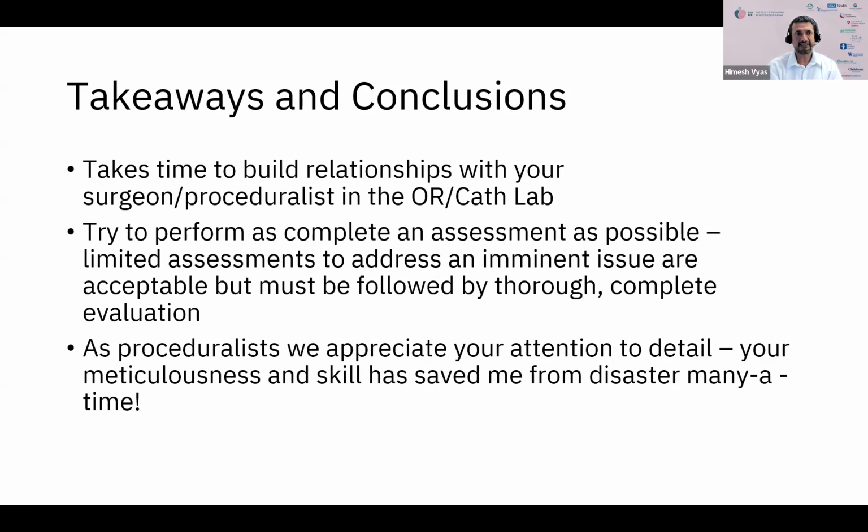Takeaways and conclusions. It takes time to build relationships with your surgeon and your proceduralist in the OR and the cath lab. And I can say this from being on both sides of this procedure. Try to perform as complete an assessment as possible. Limited assessments to address an imminent issue are certainly acceptable, but must be followed by a thorough and complete evaluation. And as proceduralists, we appreciate your attention to detail. Your meticulousness and skill has saved me from disaster many a time.